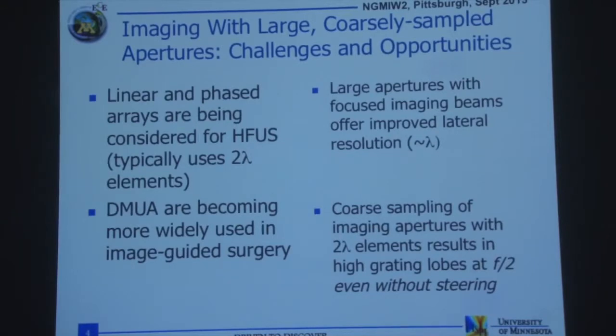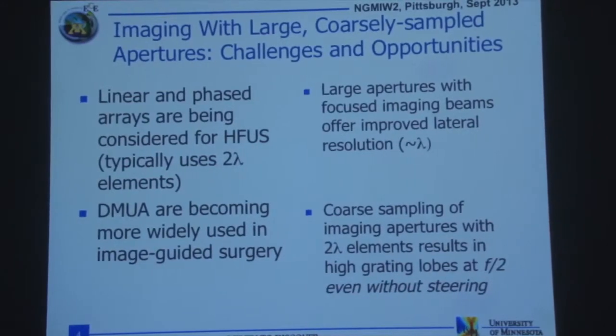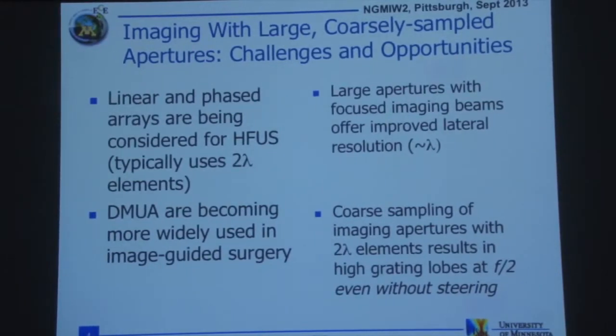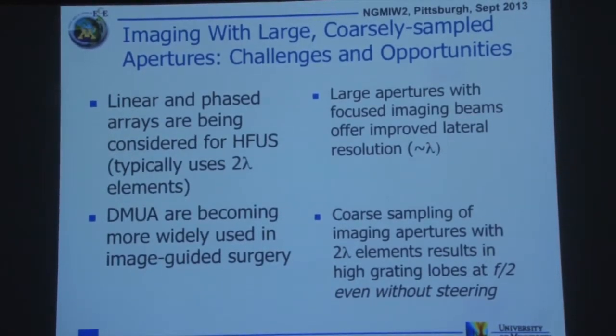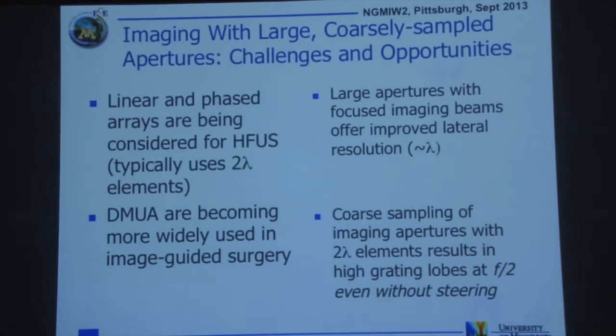But as we started thinking more seriously about imaging with therapeutic arrays, that also became part of our plan. For example, we introduced the concept of dual mode ultrasound many years ago, and now it's in practice thanks to the work of Andy Casper and Dr. Dalong Liu, who, after a couple of years with Siemens, is back in our lab to try to demonstrate some of the work that I'm going to talk about.